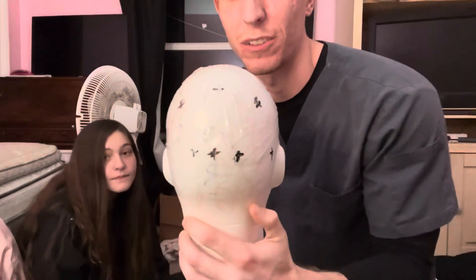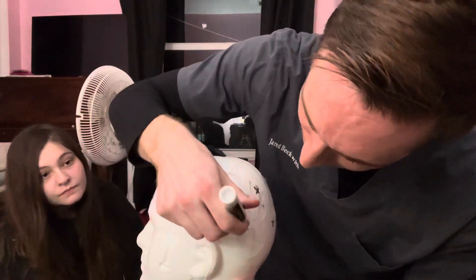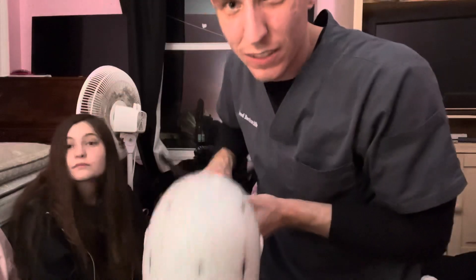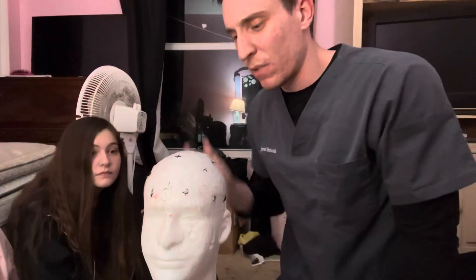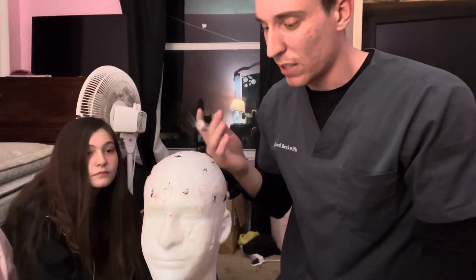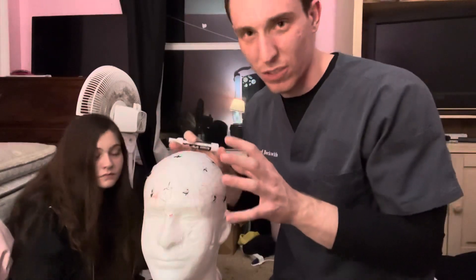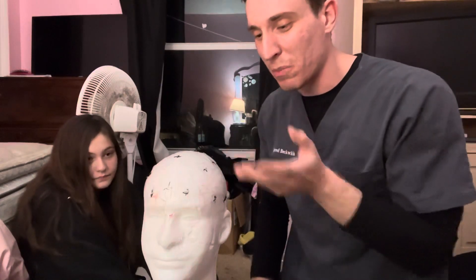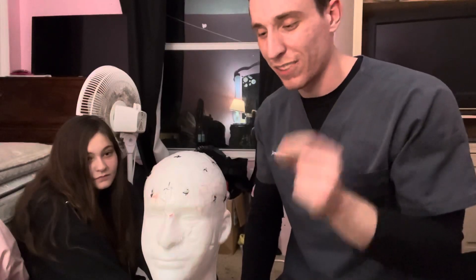Another thing I like to do — especially when I was first starting out — is when you have your erasable marker, you can take the mannequin head and write down all the electrode site names after you're done measuring. So you can drill the electrode site names of the 10-20 system into your mind so you don't forget them.